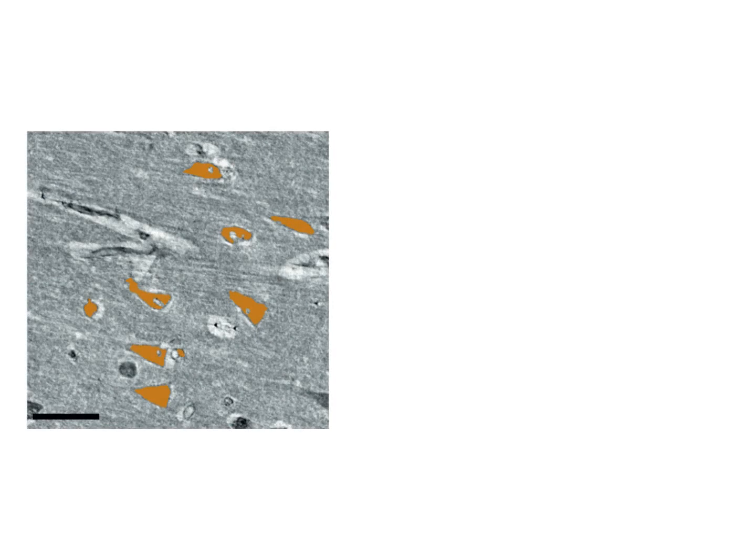Now that we have identified a list of cell nuclei, we can extract physically and medically relevant properties from each of them. This could be their volume, their density, or other similar properties. These extracted properties are often referred to as features. We can then think of every nucleus as a point, using these features as coordinates. Doing so for each highlighted nucleus in our list, the sample, which in this case corresponds to an Alzheimer's patient, can then be represented by the resulting point cloud in feature space. In the case of the brain tissue data, 5 features were used in total, but for simplicity, we will only draw 2 of them in this video.